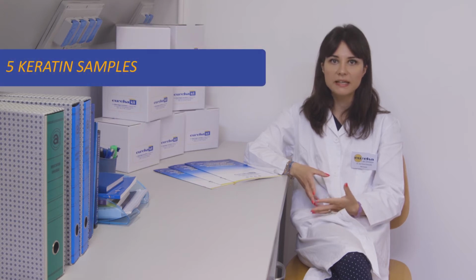At this point, we are already at a crossroads. We must follow a different preparation, depending on whether we need to confirm an amphetamine or other drugs of abuse. We take as an example a run of 5 keratin samples.